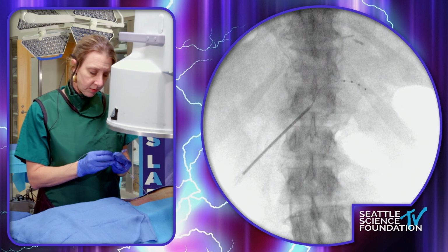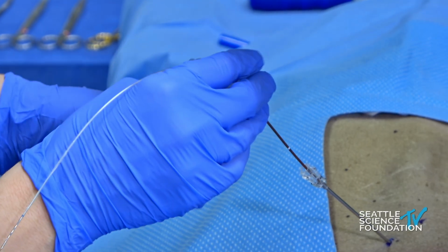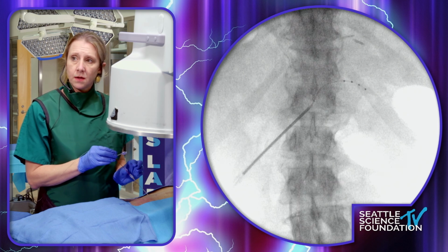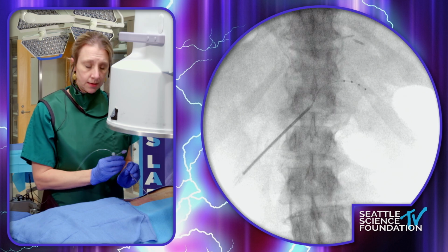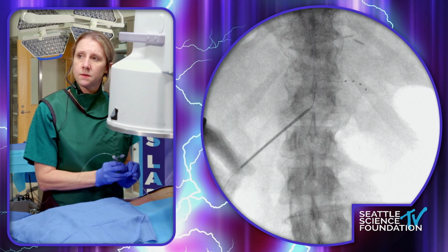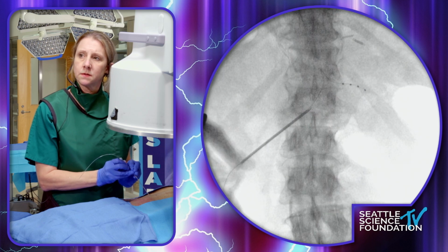And I'm going to lock down now the hub against the introducer sheath, and I'm going to rotate my whole construct. The needle and the bevel is now turned to the opposite direction, as well as my introducer sheath. And I'm going to start to advance live. And hopefully what I'll see is... stop please.